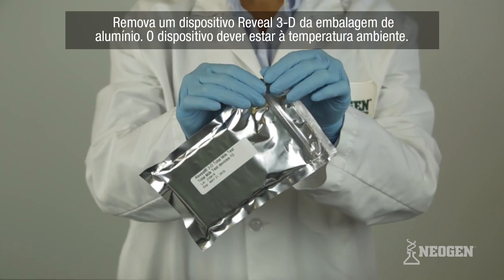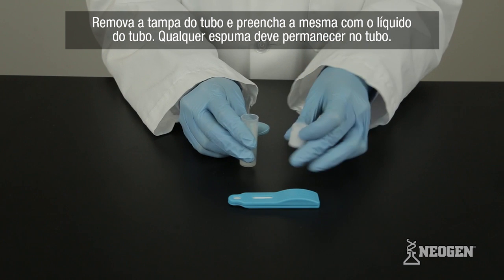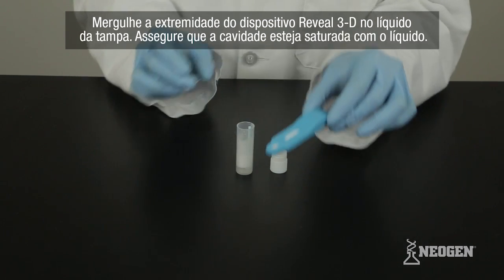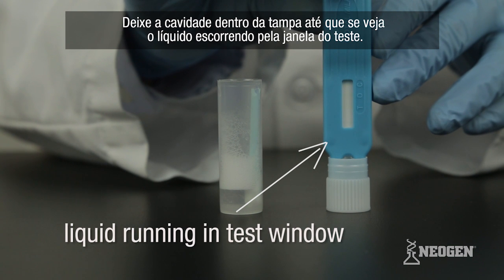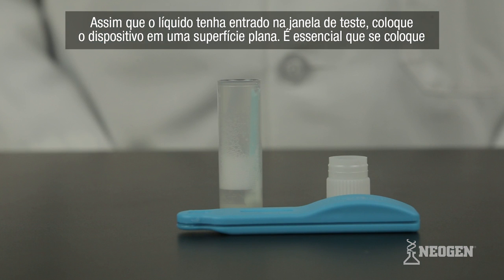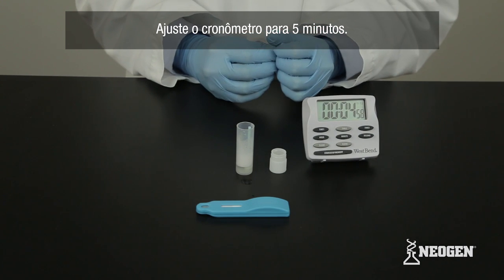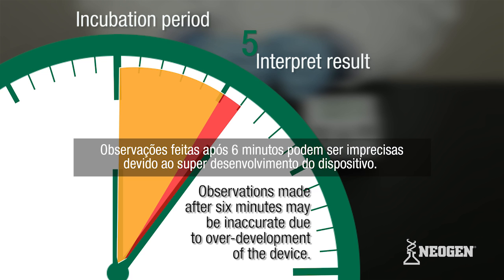To run the test, remove one Reveal 3D test device from a foil pouch that has warmed to room temperature. Remove the lid from the sample tube, then completely fill the lid with liquid from the sample tube. Any froth should remain in the tube. Dip the head of the Reveal 3D device into the liquid in the lid, ensuring the cavity is saturated. Hold the device in the lid until you see the liquid running in the test window. As soon as the liquid has entered the test window, place the device flat on a level surface — this is essential as it stimulates flow through the device. Set the timer for five minutes. Interpret the test results within one minute of the completion of the five-minute incubation period. Observations made after six minutes may be inaccurate due to overdevelopment of the device.